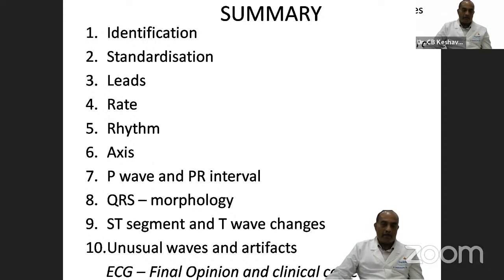Initially, you may not be able to tell everything about it, but make an attempt, make a serious attempt and write down behind the ECG itself or in a note what you have found and then discuss with somebody. That is how you learn ECG. That's how the journey of learning an ECG happens.